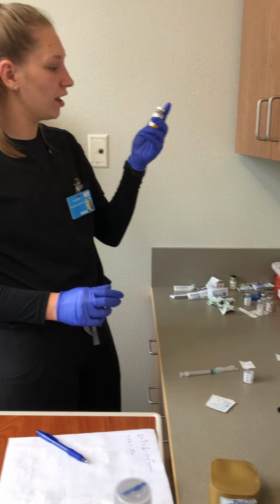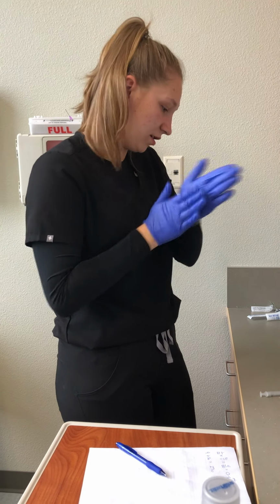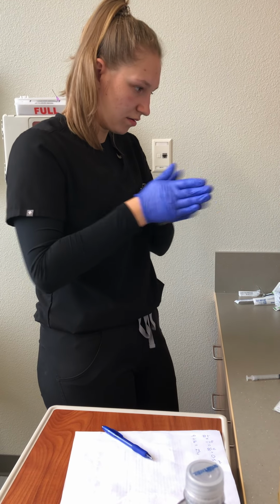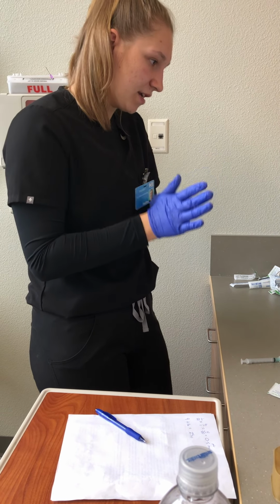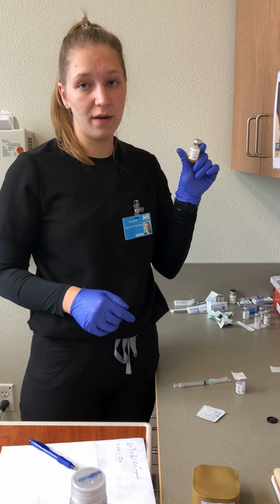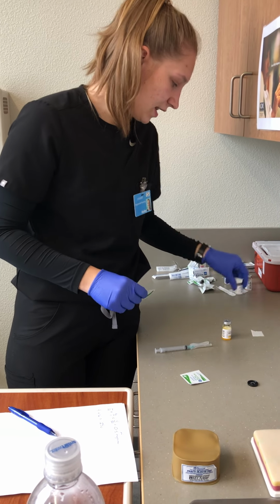Okay, so reading this vial, I'm going to go ahead, and it says that I can shake it, so I'm going to shake it and roll it to make sure everything gets all mixed up good. And because it's 330 milligrams to 1 milliliter, I'm just going to pull up 1 milliliter of ampicillin, and I've had that verified with another nurse too. So I'm going to go ahead and set that off to the side.